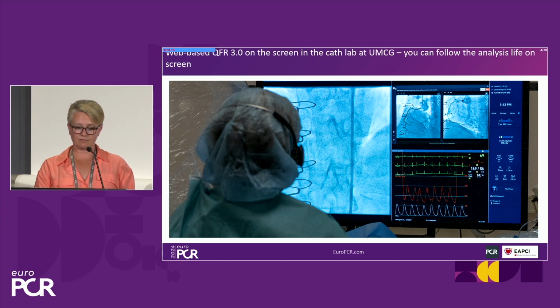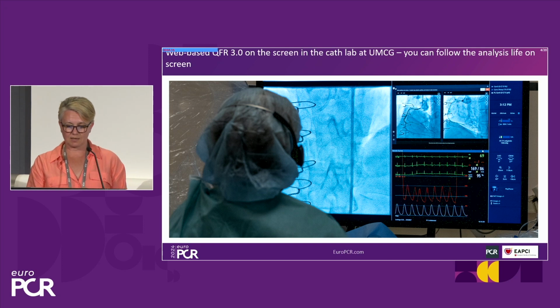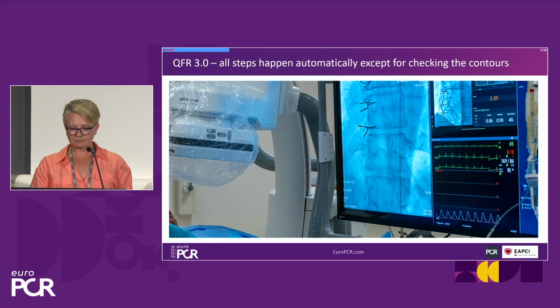And most of this is really automatic. So you only have to give them advice about correcting the contours. You can follow the analysis live on screen. All steps indeed happen automatically.